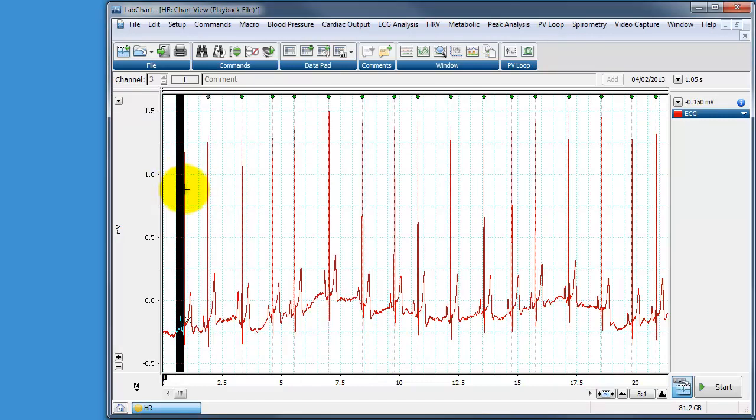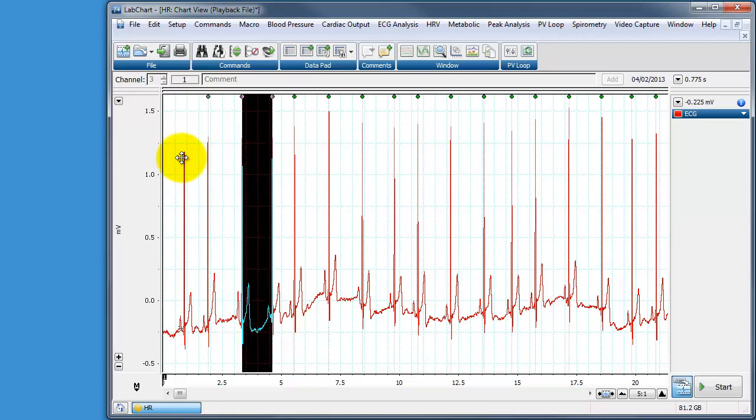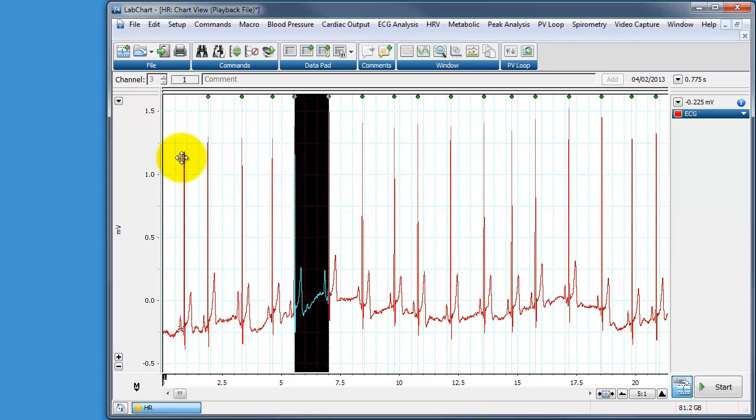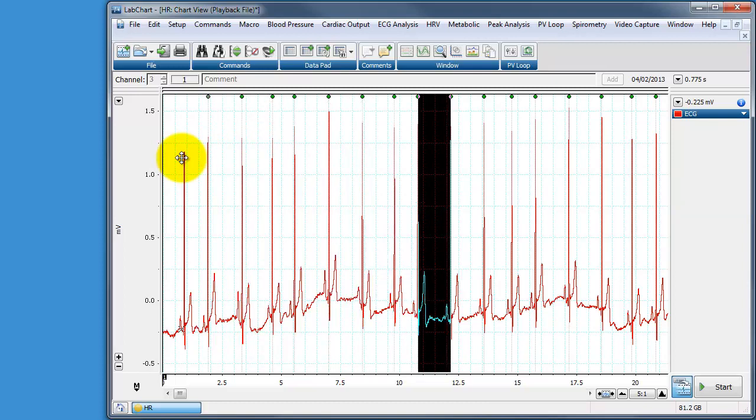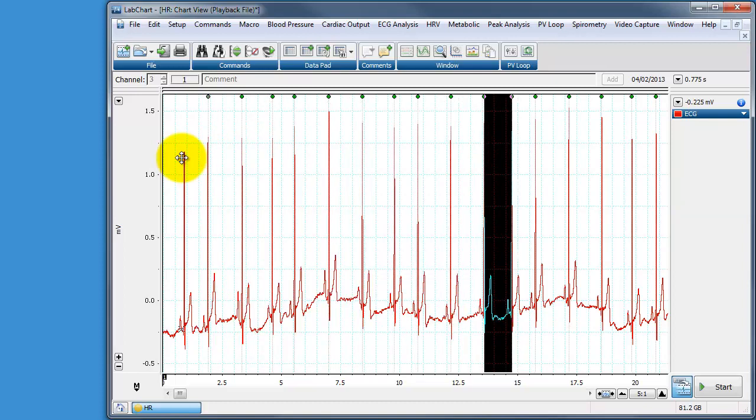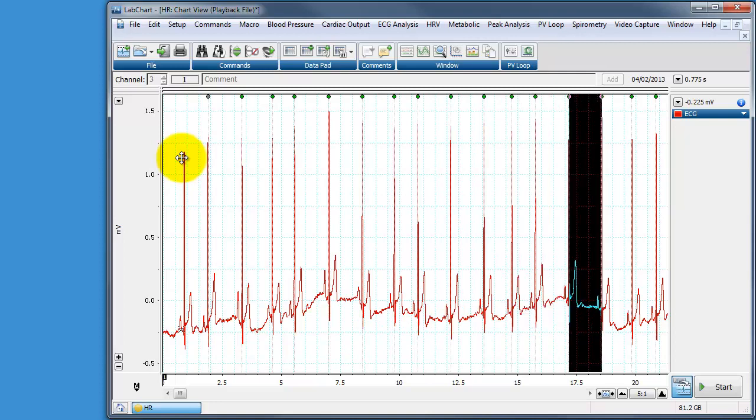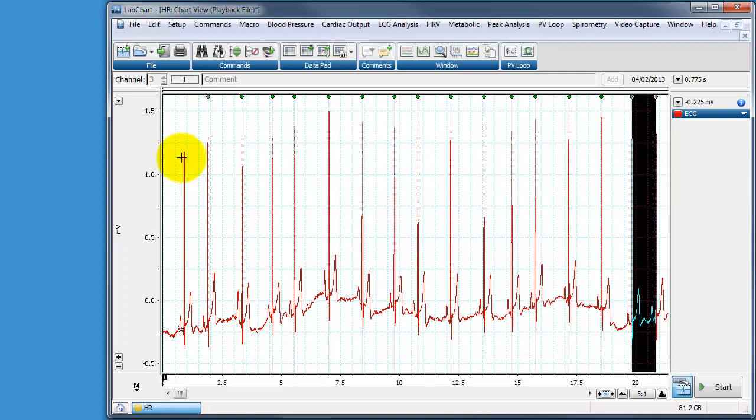So you press find and you can see it's selected an area, it's indicated here by this black section, from where the cursor was to the first R wave. Even if I repeat this, it will then select the area between each of our R waves as we go through the file. So that's very useful.